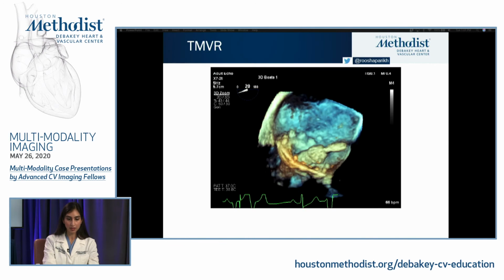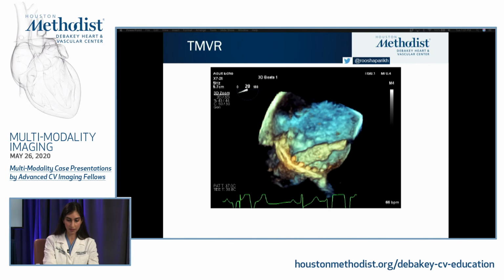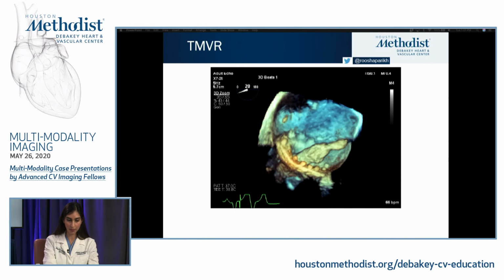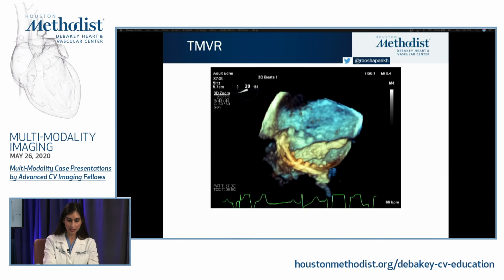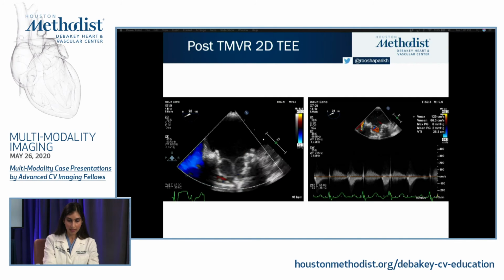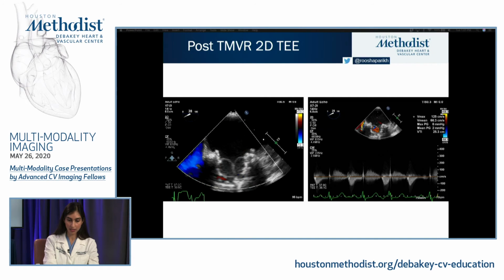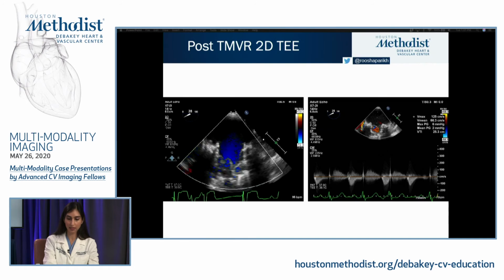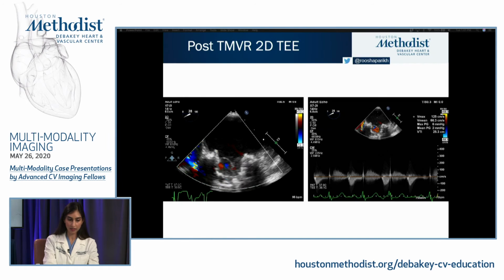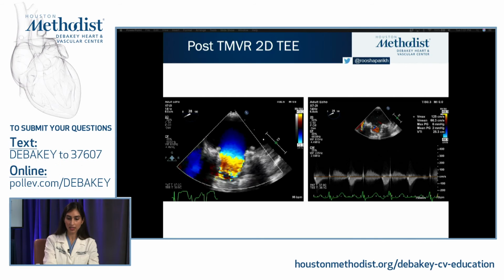Next, we have 3D images showing the Edwards Sapien 3 26 millimeter valve being deployed across our bioprosthetic mitral valve. This happened with rapid pacing of the RV. This is the final image of the valve in the mitral position. We see that the leaflets are opening and closing normally, and there's less than trace residual mitral regurgitation. The mean transmitral gradient was 2 millimeters mercury at a heart rate of 70 beats per minute.